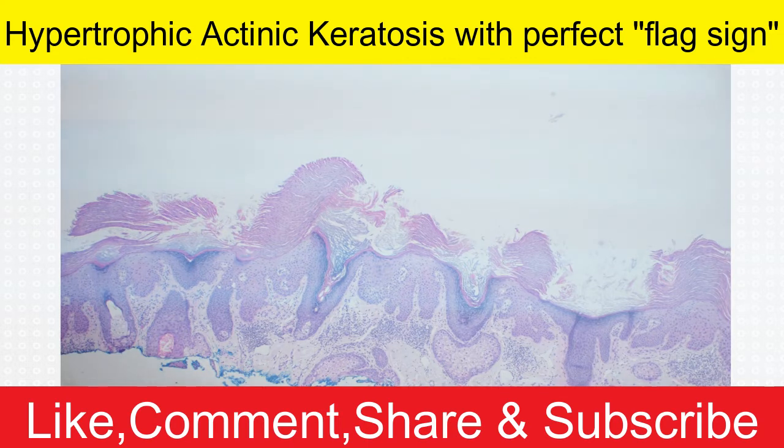And you particularly see it in actinic keratoses that have a real thick layer of parakeratosis. So I would call this a hypertrophic actinic keratosis because it's thick. Some people would also say it's hyperkeratotic. I kind of lump those two terms together, even though technically they are different things.